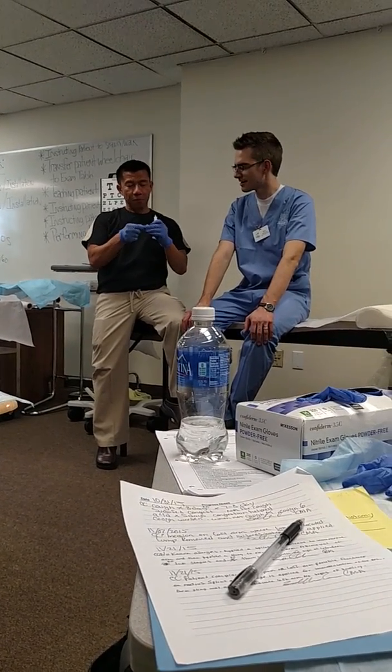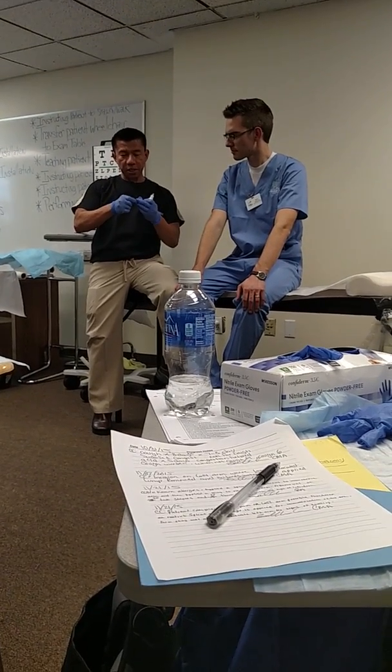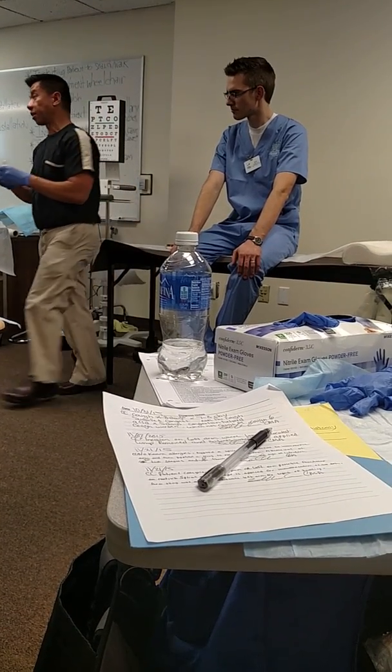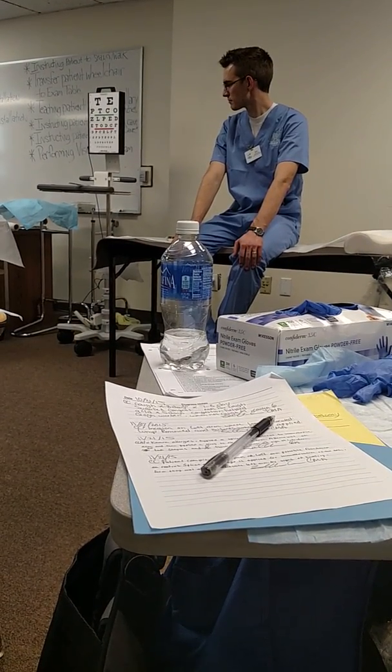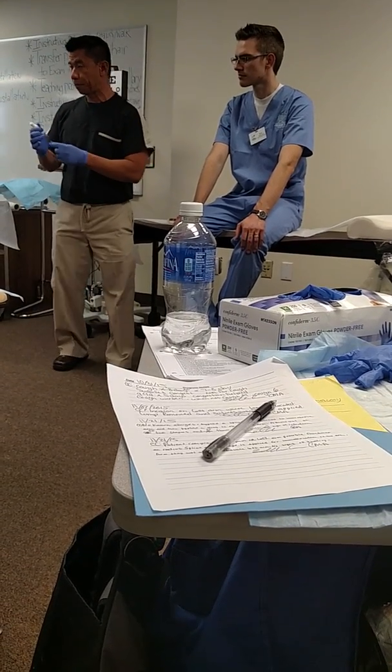All right. So, one thing that you need to remember is that some of these medications are multiple use. It's always used in a clinic for multiple patients. So you want to make sure that the dropper doesn't touch the patient's what? Ear.